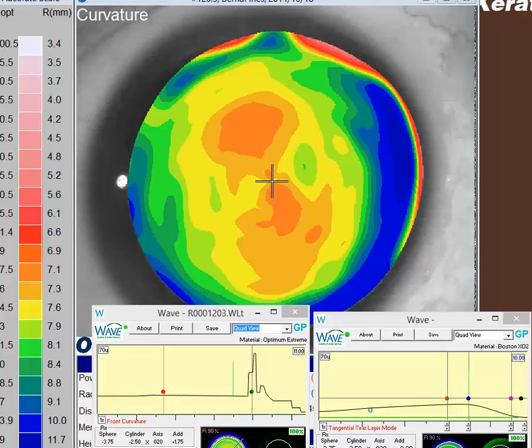I see from your clinical request that with these designs, you're having an unexpected overrefraction, and you have some questions regarding the pupil size. Well, if we look at the overall lens, I understand this patient is going from soft to a rigid lens, and it sounds like you've won half the battle if the lenses are comfortable.